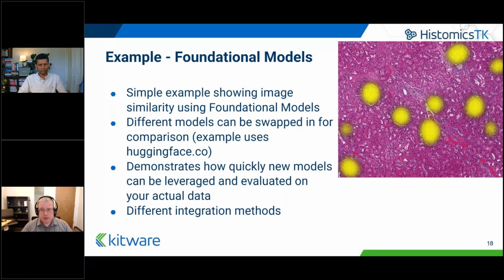And so these foundational models exist. If you're starting your analysis of a task, is there already a model that gets you most of the way there? Then you could use it. But if there isn't, then maybe you need to do something else. And so rather than train from scratch, you can try out these models.